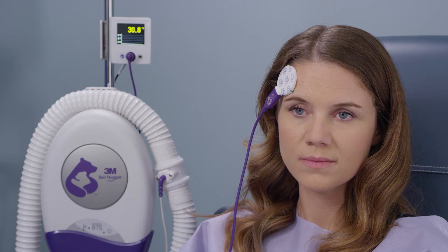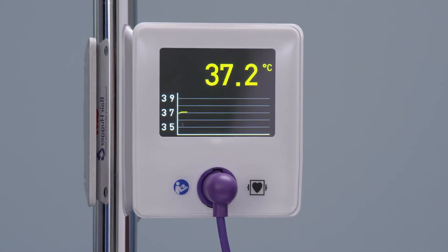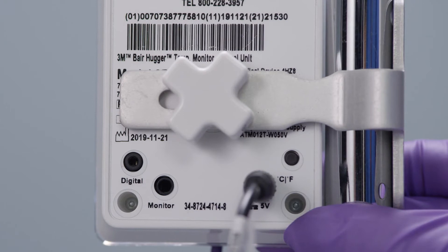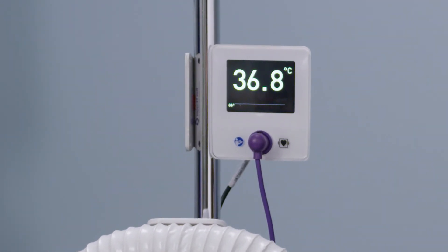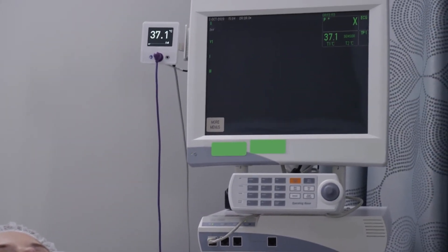The control unit will sense patient attachment after several seconds and the unit will display the equilibration screen. The flashing yellow temperature display and a graph below the temperature will indicate the progress of equilibration. The control unit can display temperature measurements in either Celsius or Fahrenheit. Push the temperature display button on the back of the control unit to change the display; the unit is factory preset to Celsius. The patient's temperature will display in bold white numbers when equilibration is complete, and will also display on the connected patient monitor if applicable.